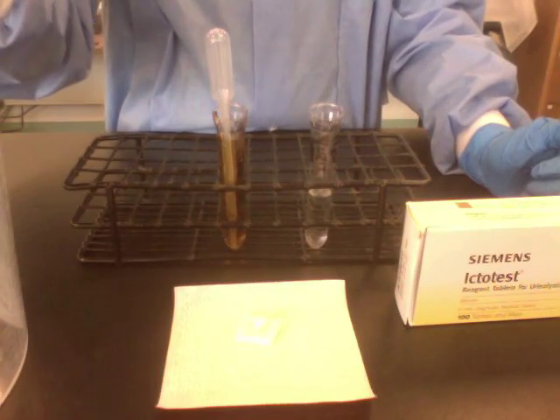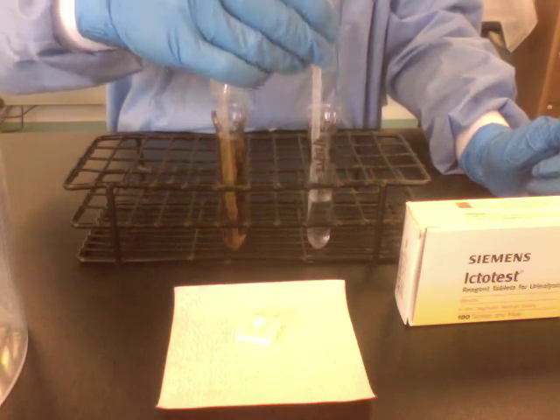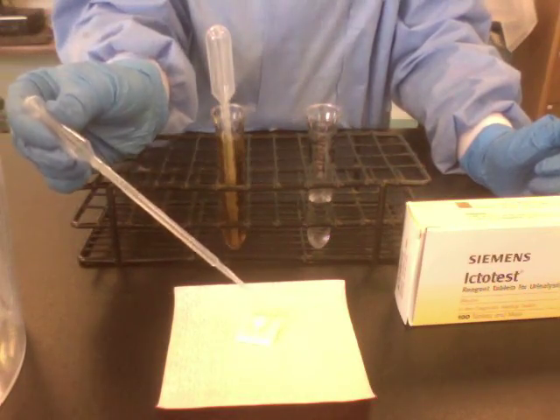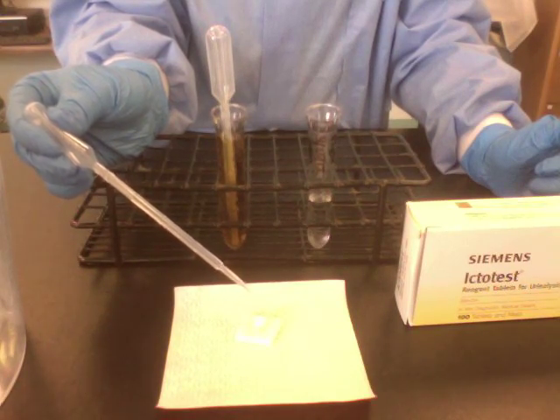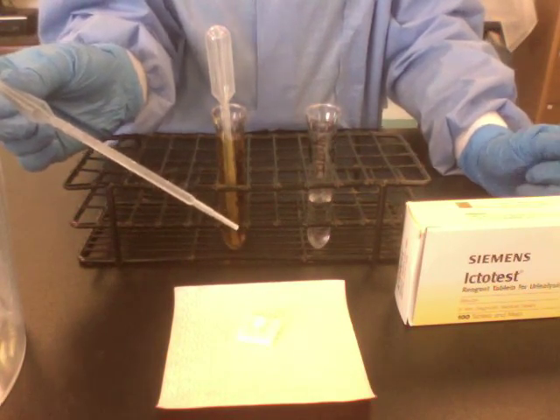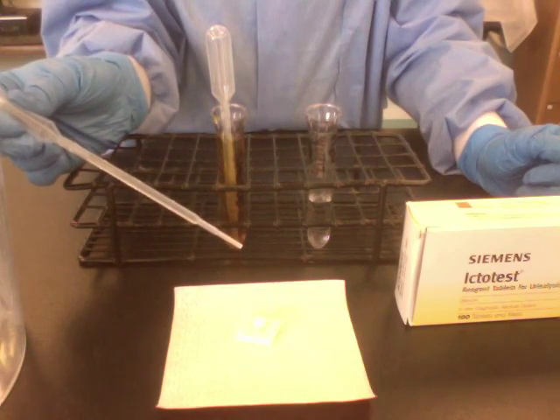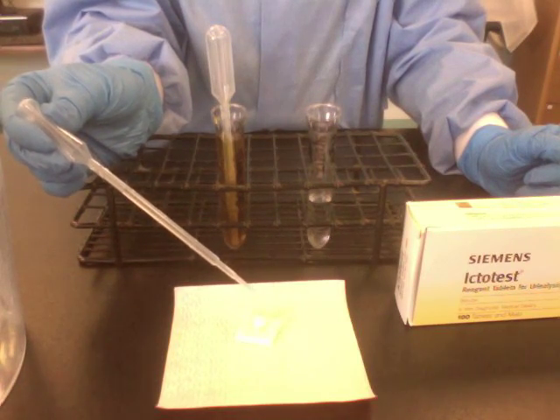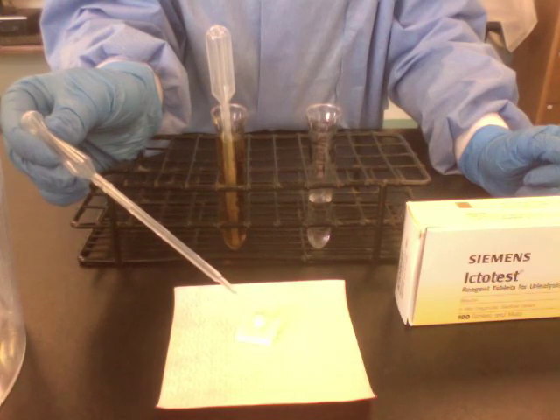And now we are going to add one drop of water to the tablet, and then one more drop and let the color run over.